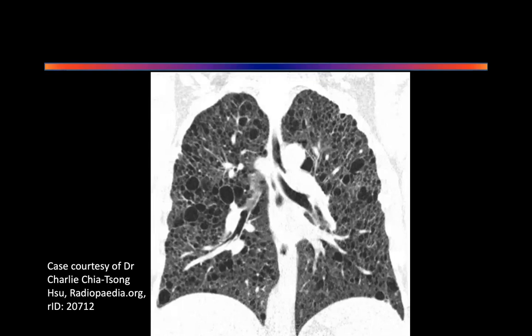Sir, I can't make out the beginning of the right pulmonary artery very nicely. But look into the lung. I'm not talking about this. This you cannot see because the section is not going through there. I'm talking about this. Is it more vascularity, less vascularity? Sir, there is less vascularity, because I cannot see the vascular structures all over. I can see the contrast, so there is more central opacification of the vascularity, but in the periphery I think the vascularity has gone down, right? Yes. Okay, everybody happy with that?